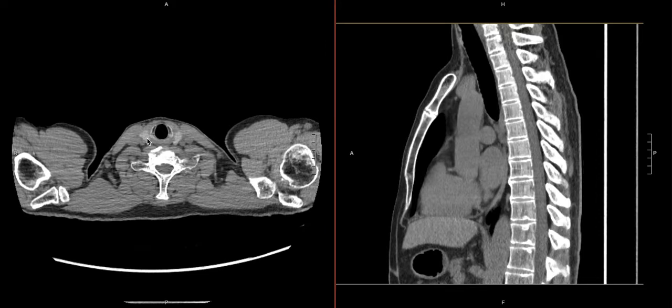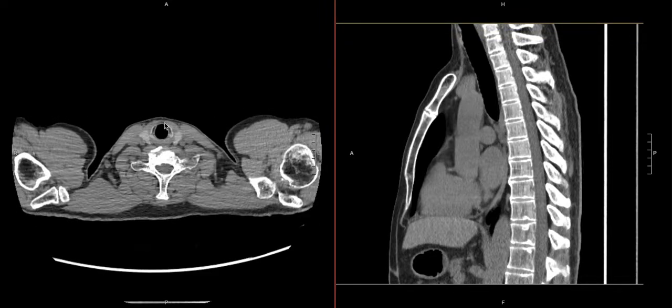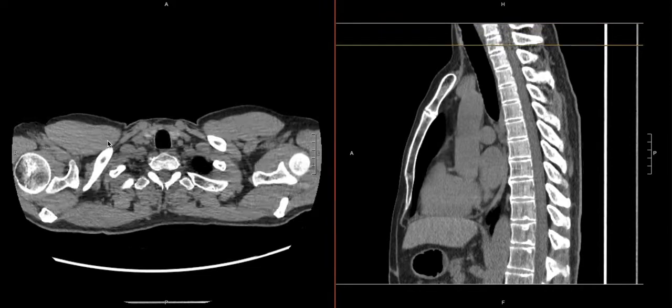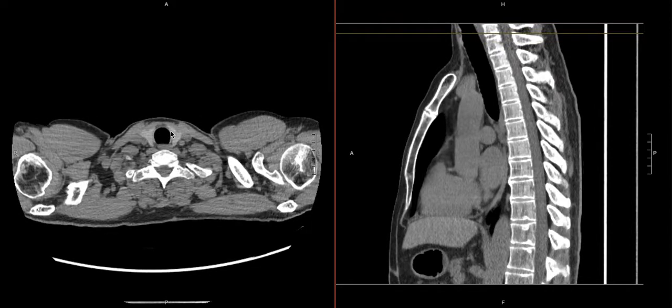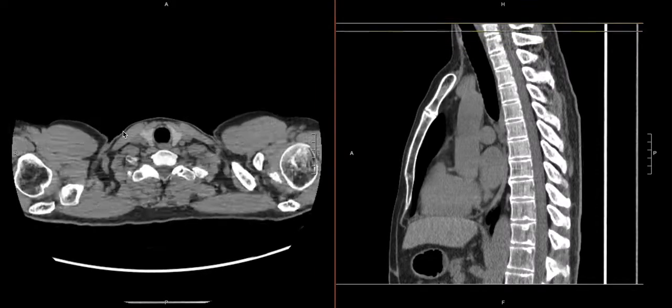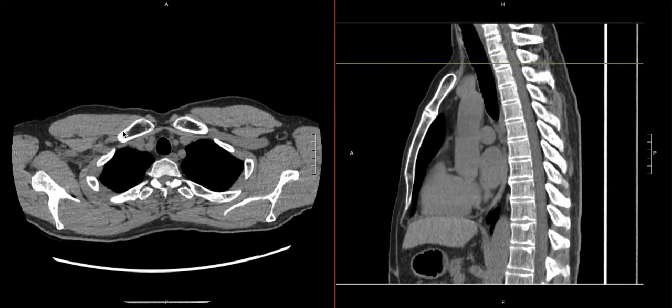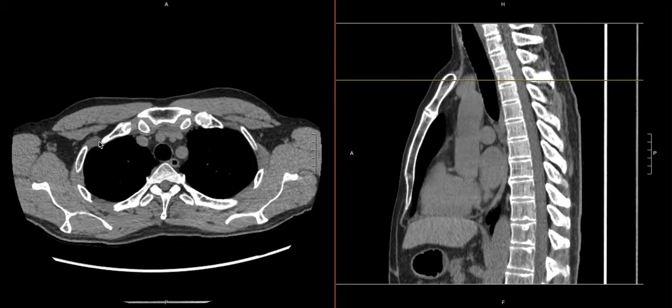submandibular or parotid glands. So we can start here with the thyroid that's just draped over here, and we can scan up and down. This is all still thyroid, looking for nodules or anything suspicious. And then we can go a little bit lower once we get past the thyroid. We'll save the mediastinum for later, but we'll stick more anterior for now for the soft tissues.